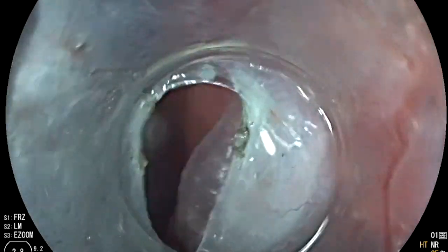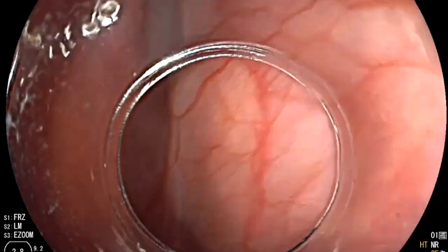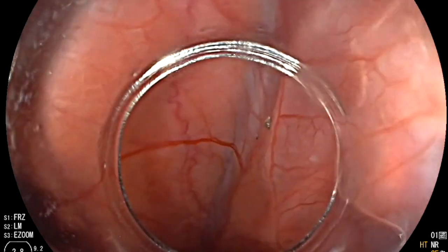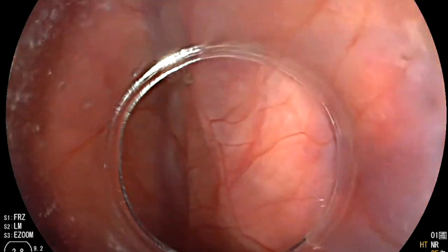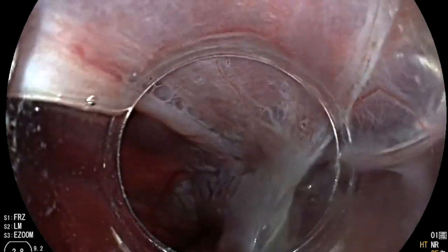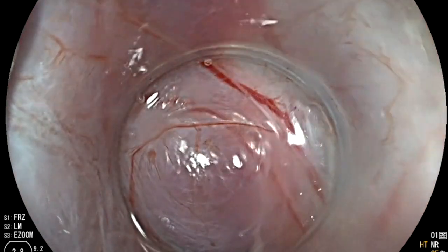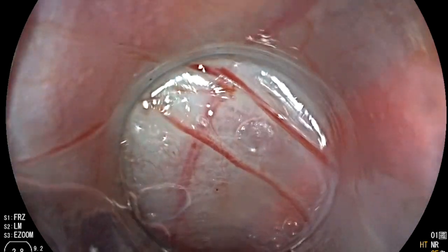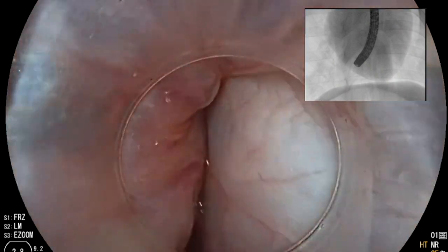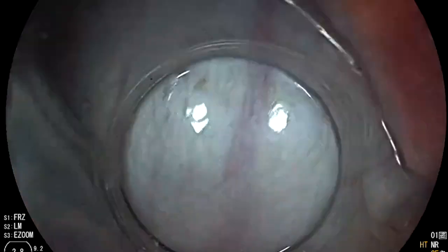Here you can see the vagus nerve traveling downwards along the esophagus. After we reach the diaphragm, we retroflex the endoscope to visualize the pericardium. Here you can see the epicardial vessels within the pericardium.